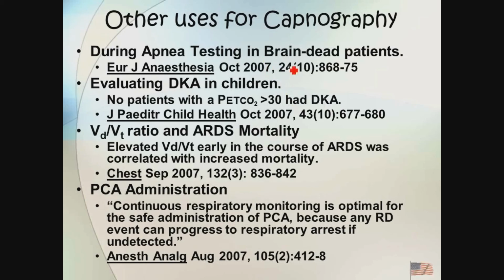And then we talked about what's PCA? Patient-controlled analgesia. Give me my drugs. I push a button and it's hooked up to a morphine pump. Problem is that we usually monitor these people with pulse oximetry. Argument could be made we should be monitoring them with end-tidal CO2. I think I made that point earlier about conscious sedation. The American Society of Anesthesiologists now recommends all patients receiving conscious sedation should be on end-tidal CO2.